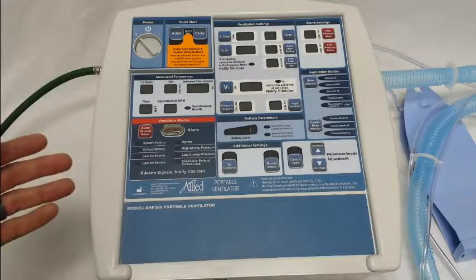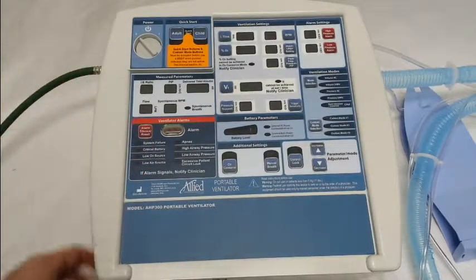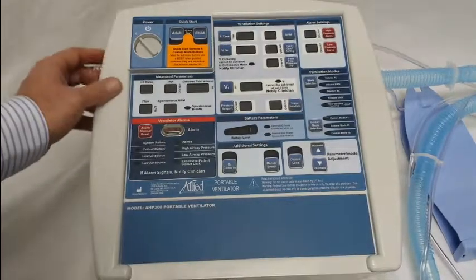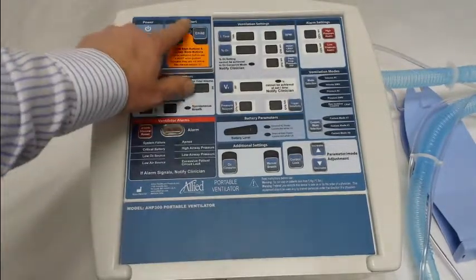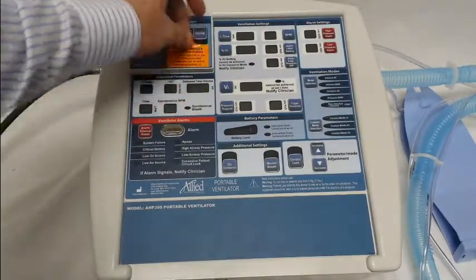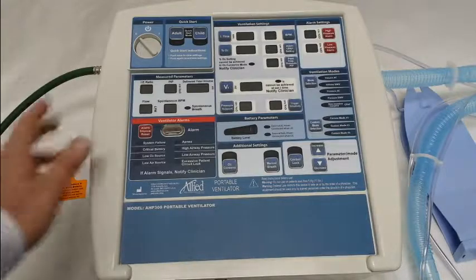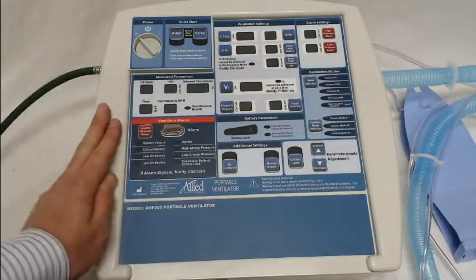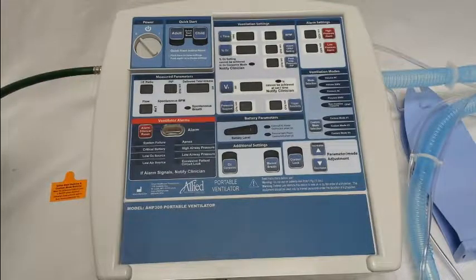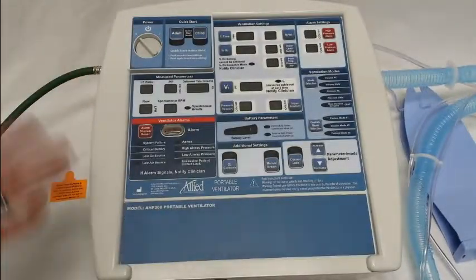This video will show you how to quickly and easily enter the programming mode, set the settings that are desired for the institution, and save them so that you're ready to use these quick start modes. When you open up the box and pull the ventilator out, there's an orange sticker that says these are not able to be used until they're either confirmed or programmed. I would recommend having an oxygen hose available and having your circuit and a test lung available — that'll prevent any alarms and make the programming easier.